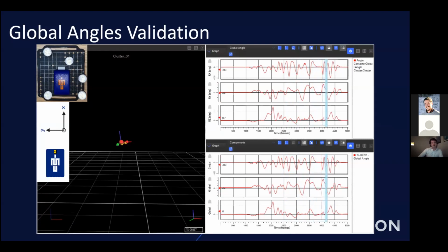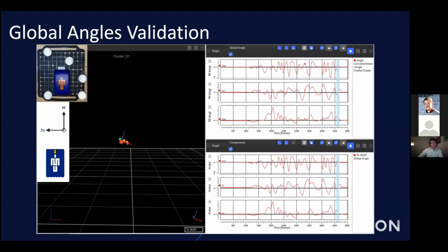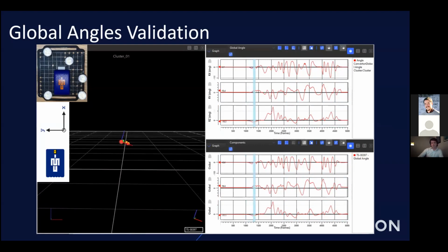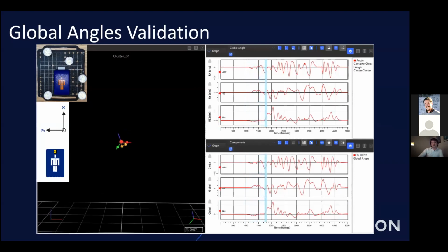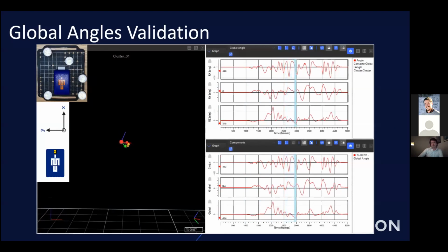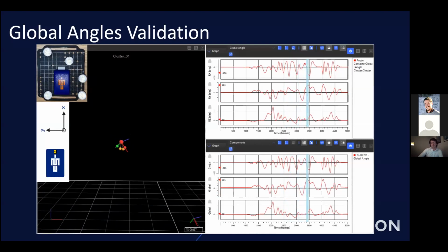An IMU has just been attached to a rigid cluster here, which is being tracked by the cameras. And as you can see, the global coordinate systems have been lined up as best they could. The top graph that you can see here shows the cluster data itself, so we can take this as the object's true rotation. And the bottom graph is showing the global angles that we can get from the sensor itself.